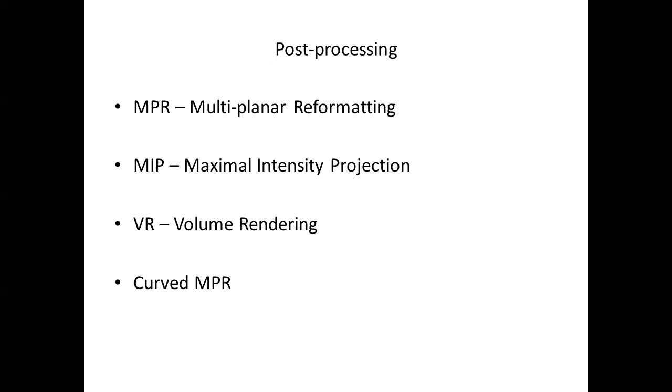Volume rendering, we don't really use it, but that's sort of your 3D data set. It just makes pretty pictures, but we don't use it for diagnosis. Curved MPR is the same as MPR, just you've now laid out the coronary in its entirety, and I don't really find it that helpful, so I don't use that. So I'll use MIP, look at the vessel.